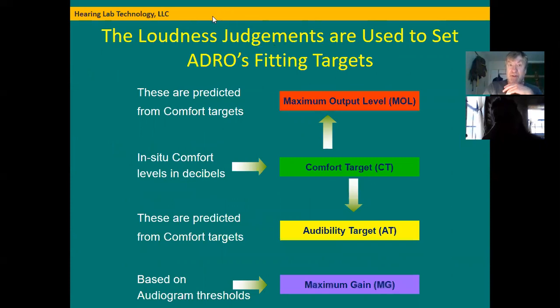So that's essentially how the system works. It's just trippy. It's just different. I don't know if I'm a huge believer in it, but I want grads from OTC to have a basic idea that this hearing aid is floating around out there, and that there's a whole legion of HISs out there fitting it. Those people are fitting hearing aids very differently than what you're being taught. You're being taught to fit according to targets, and about knee points and programs. But this kind of hearing aid is weird. It's just different. So I just want people to have a passing awareness of some of its salient features.